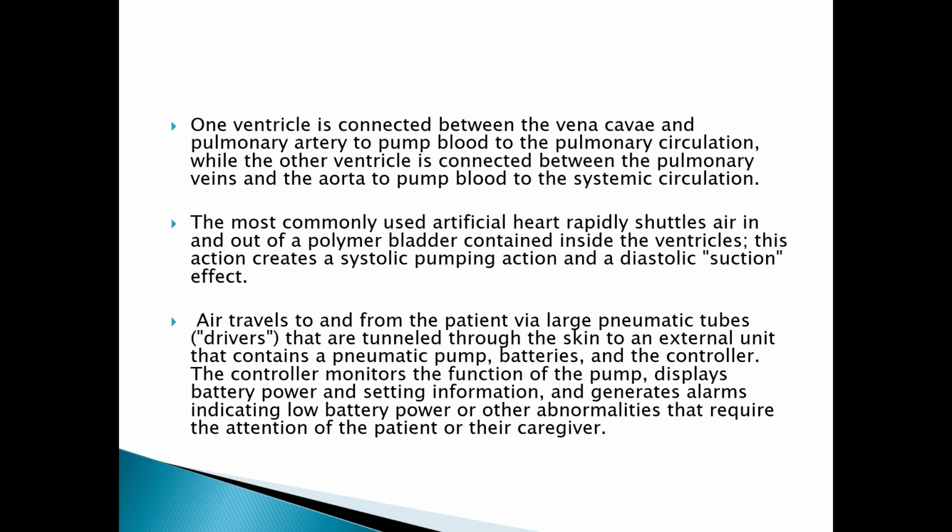This action creates a systolic pumping action and a diastolic suction effect. This air travels to and from the patient through a large pneumatic tube that is tunneled through the skin to an external unit that contains a pneumatic pump, batteries, and the controller.